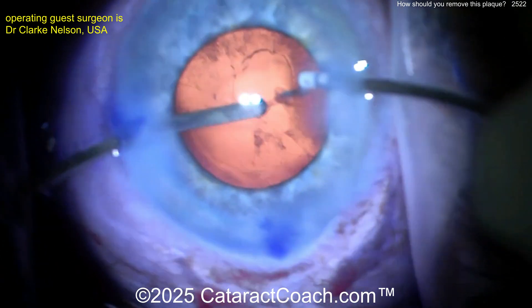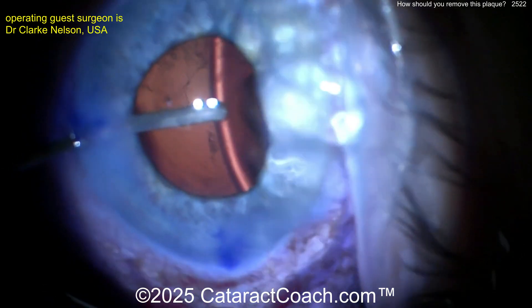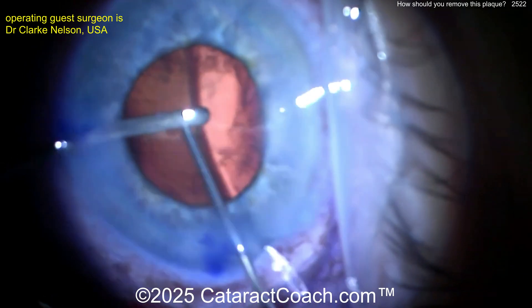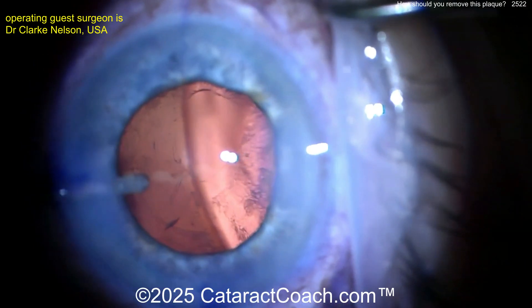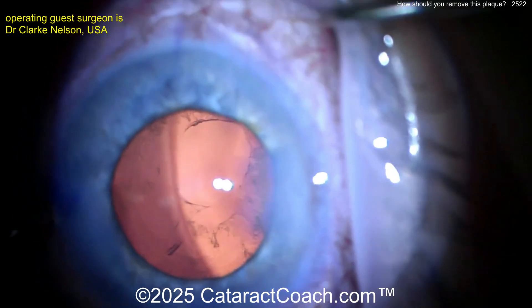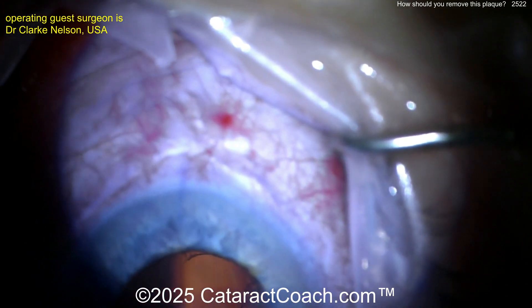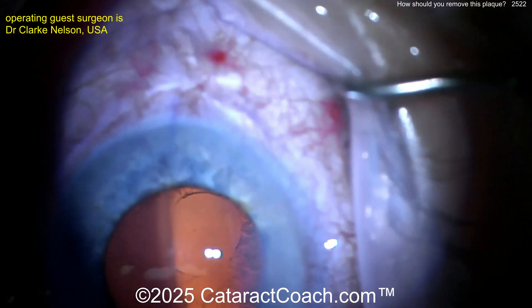But here now — look — did you get the piece off? No, you open up the bag. Look, the posterior capsule is open now. There comes some viscoelastic out of there, but it's okay — the patient had a full vitrectomy already. The hard part now is going to be: can you get this into a round capsular opening with no weak edges? That's the challenge here, and it may be harder than you think, especially in a post-vitrectomy eye. There is no anterior hyaloid face — there's nothing to provide any support there. You've got a loosey-goosey capsular bag just floating around in there.